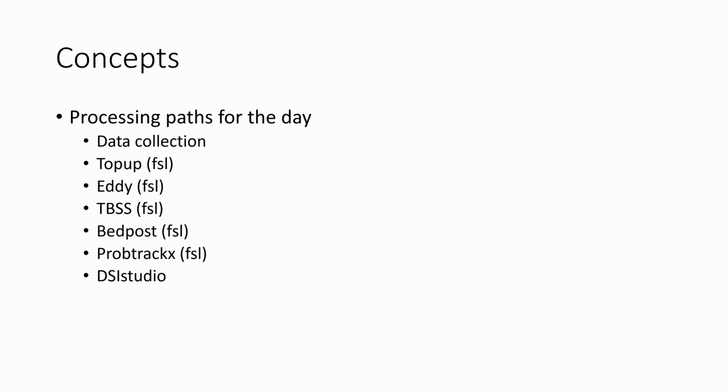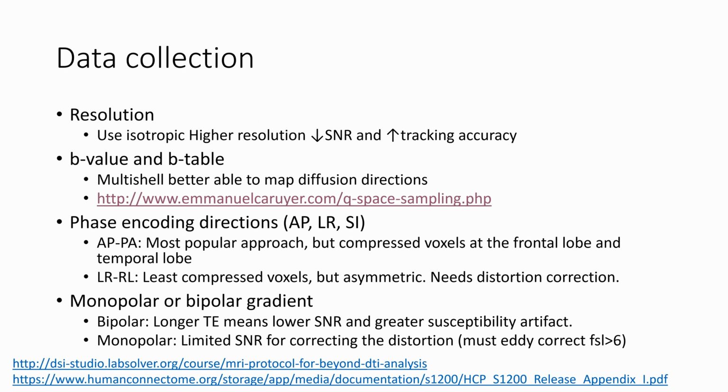Similarly, with the top-up and eddy, there are some automated scripts at the center which make it a whole lot easier than doing those things yourself, specifically with a top-up. So I'll touch upon what goes into that, but I won't drag you through too many of the gruesome details. But, things to think about.